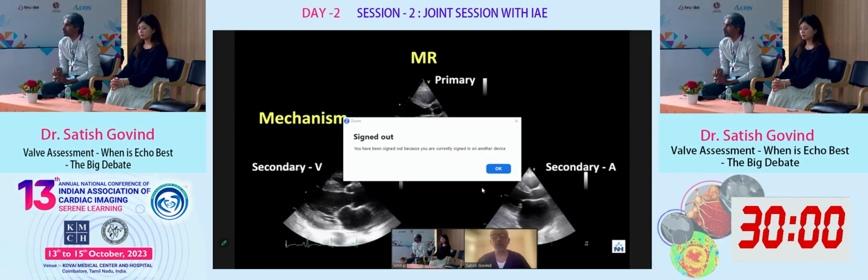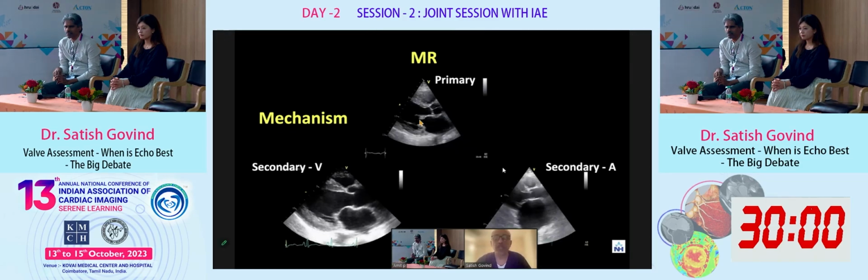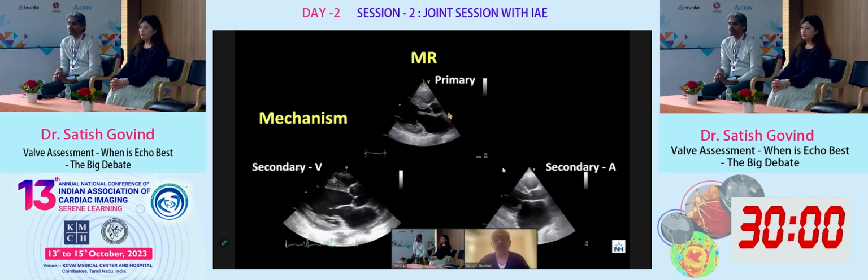Now, moving on to MR. So this is really the big fellow here in the room. So the MR is the one. The echo is the first line again. And what we identify as soon as we start to look at the MR is the mechanism. So here you have primary MR, which is the leaflet problem. So you can see a flail leaflet over there. And then you have the secondary MRs. So in secondary MRs, you have the ventricular dilatation, which is causing the MR. And on the other side, you have the atrial dilatation, which is causing the MR. And echo is fairly good at identifying these three entities.